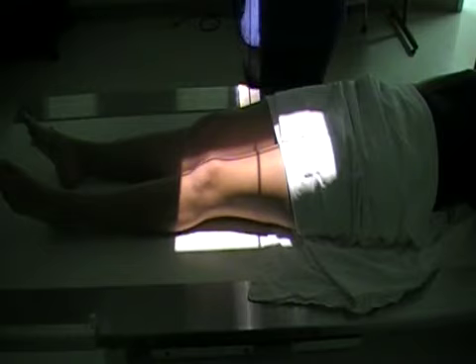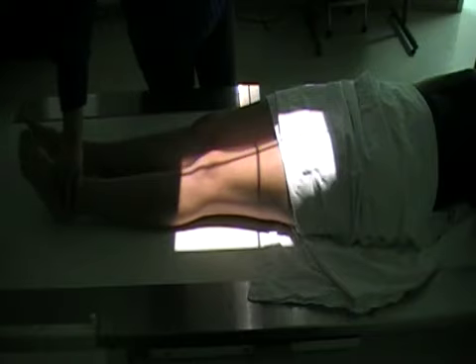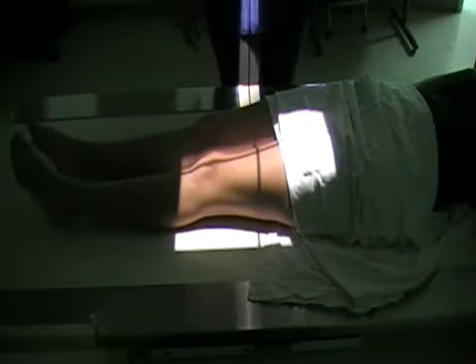will get on our second image, which will be a 10 by 12 to include the proximal femur and the hip joint. Just keep in mind, whenever you're dealing with long bones, you want to include both joints. Okay, now I'm going to rotate the leg inward. Okay, and this will be our AP femur to include the distal femur.